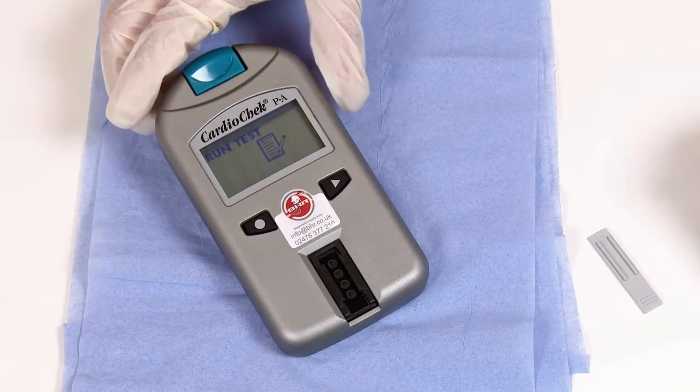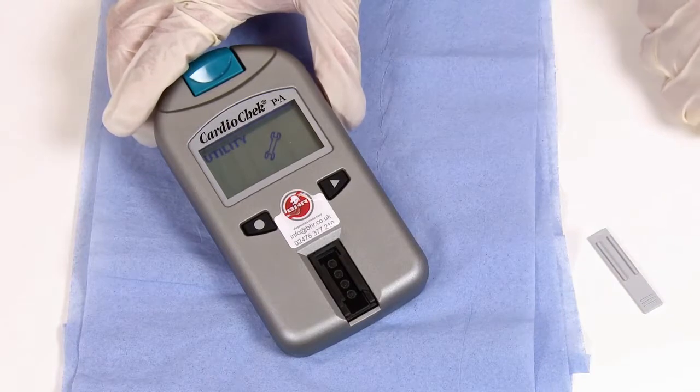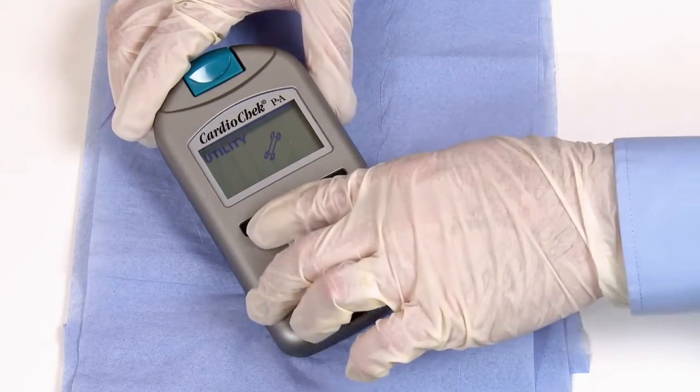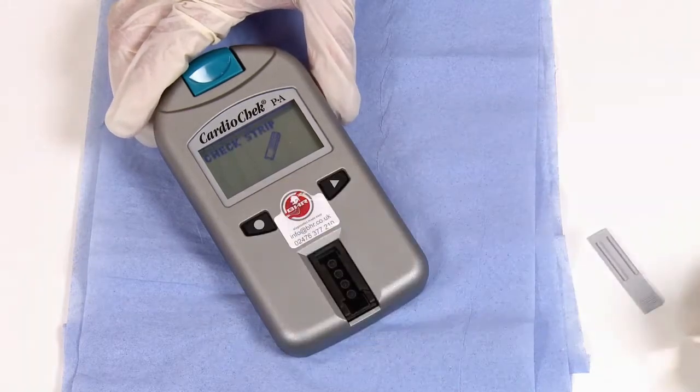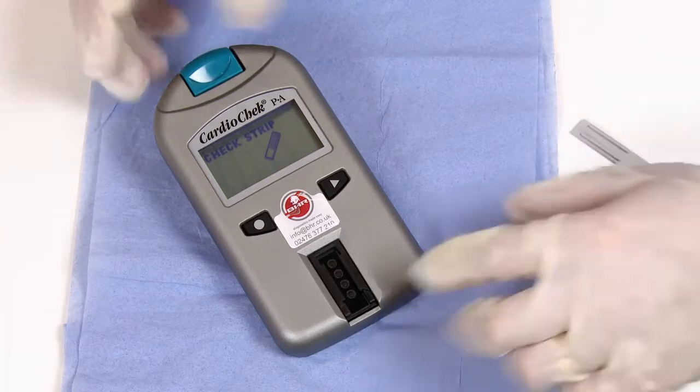Press the next button twice to reach utility, then press the circle button once to enter. When you see check strip, press the circle button once to confirm you wish to run a check strip.